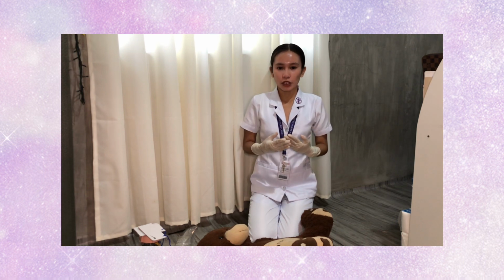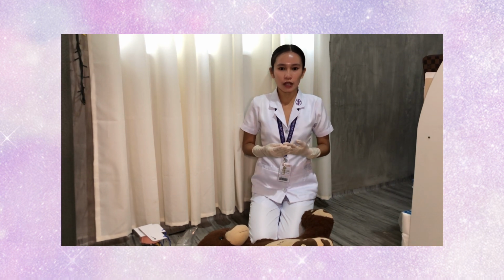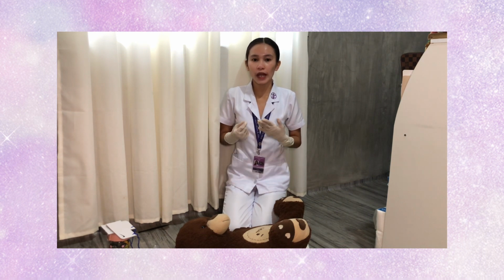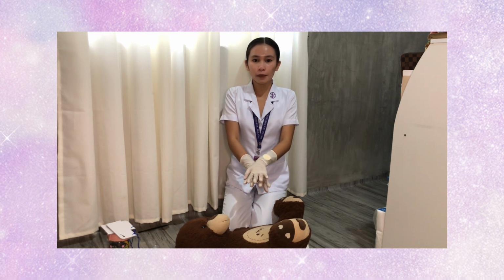So determining that my patient has no pulse, is not breathing and is unconscious, now I am going to perform CPR. CPR is the life-saving skill that combines chest compressions with artificial ventilation to maintain brain function and restore spontaneous blood circulation and breathing to patients who have gone into cardiac arrest. So now first locate the chest area of the patient and place the hands on the lower half of the sternum. Then start doing 30 chest compressions at a depth of 2 inches.